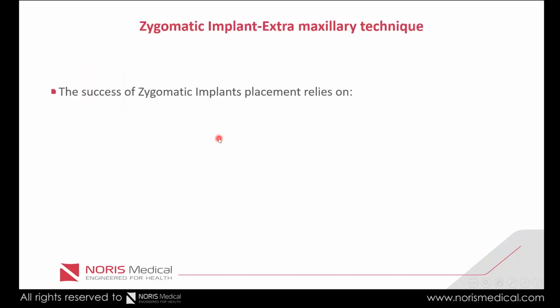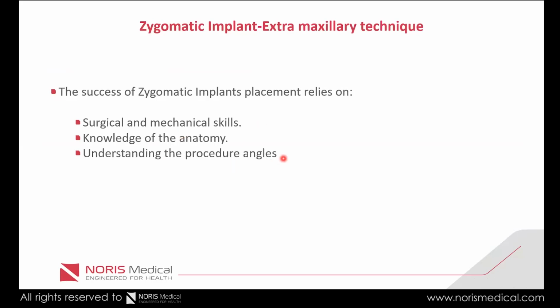So, what is needed for the extramaxillary technique? The success of zygomatic implant placement relies on surgical and mechanical skills, of course, on knowledge of the anatomy, understanding the procedure angles, good 3D visualization ability, we'll see that later on, and of course, good planning.